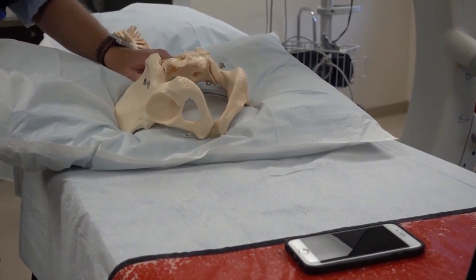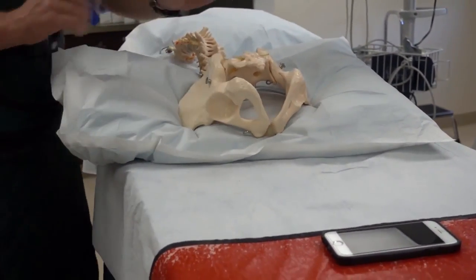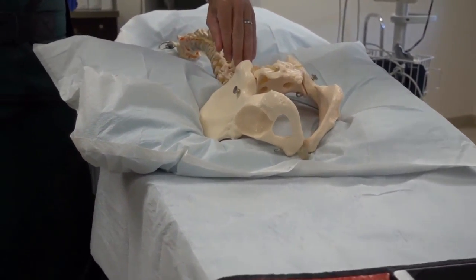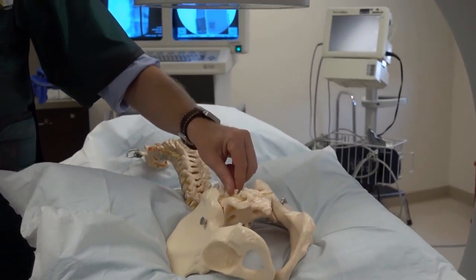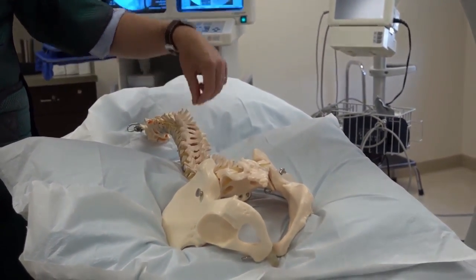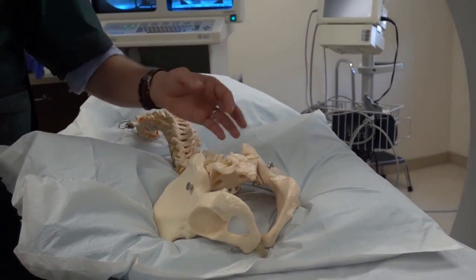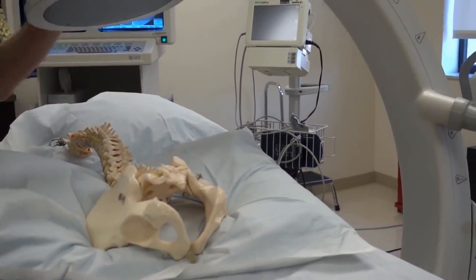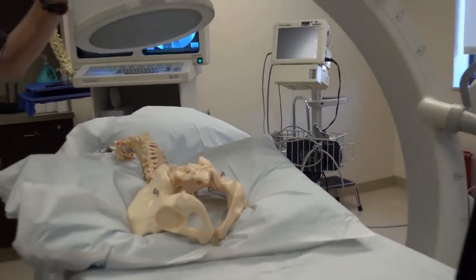not the normal 5. That said, you want to show the doctor the sacrum. Once he or she sees the sacrum, they can count up, okay, and then know that this would be L5, L4, L3, L2, L1, T12, etc. Let's say we're going to do an L5. What we do is we come down here, we show the doctor the tip of the sacrum, and also you're going to see the L5 vertebral body.